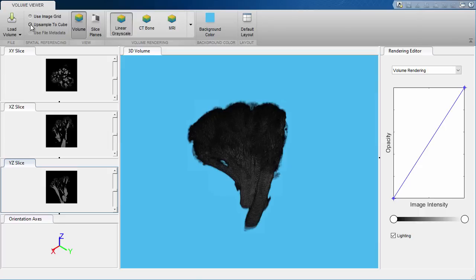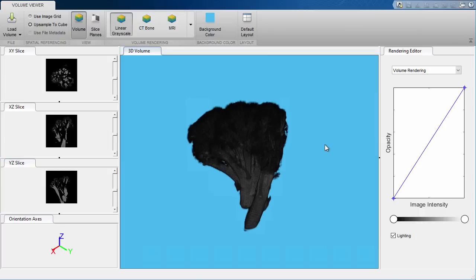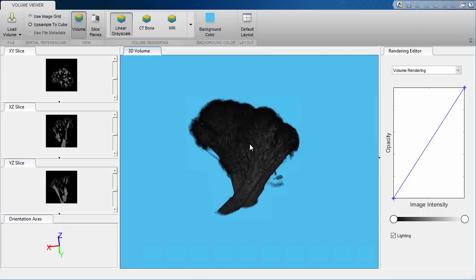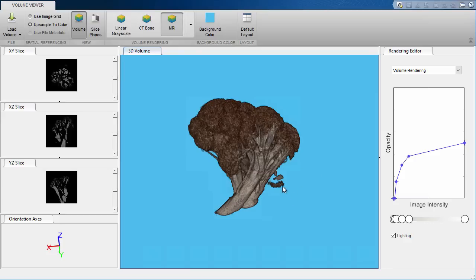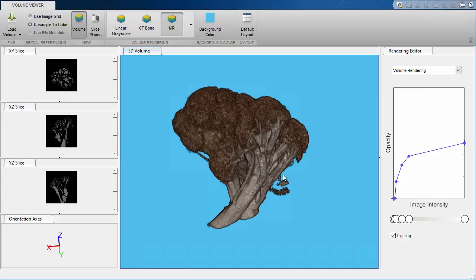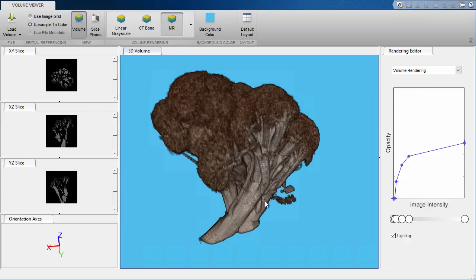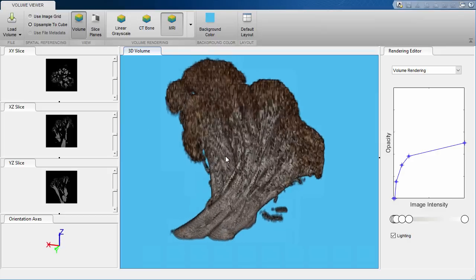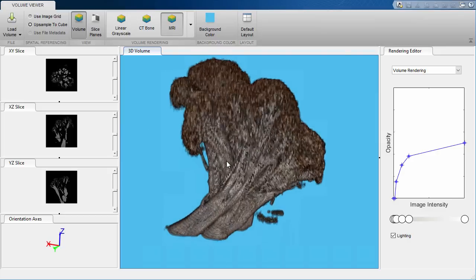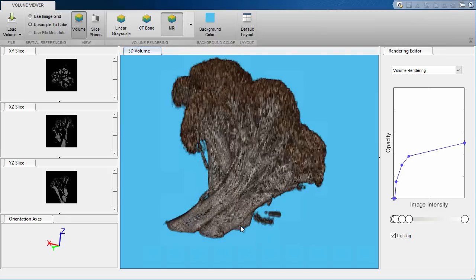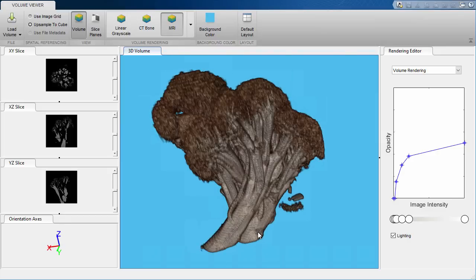We can then visualize the result and see how well the segmentation worked. If the idea worked, great. If it didn't, that's fine. You can see this, try something else, and visualize those results too.